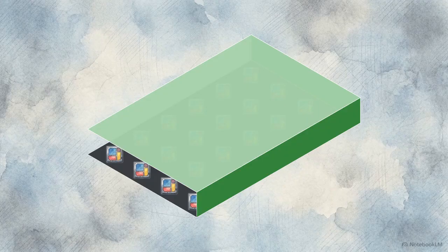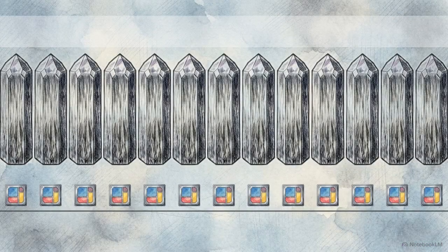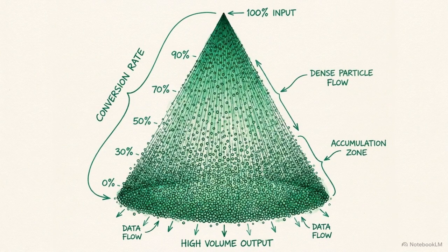The first DR architecture is indirect DR. It achieves instantaneous data transfer, but it relies on a scintillator acting as an optical middleman. Below the X-ray window sits a 500 micrometer thick scintillator layer of cesium iodide. To prevent lateral light scattering, it is grown into a channeled needle-like crystal structure, forcing the generated light to travel straight down. The conversion rate is massive. The absorption of a single X-ray photon releases approximately 3,000 light photons in the green part of the spectrum.